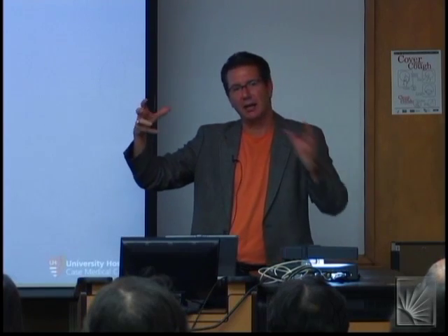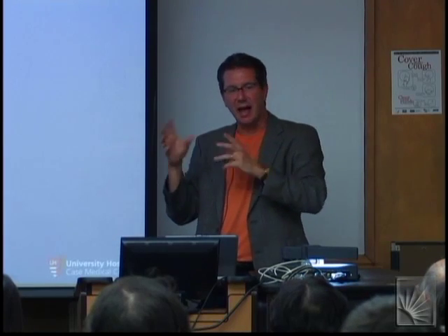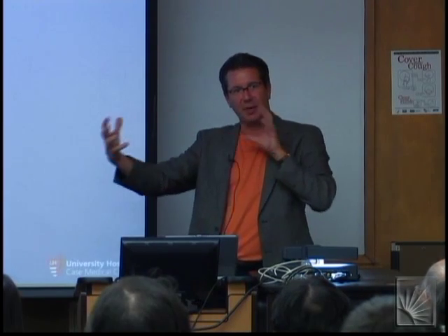So we can image much, much faster than we can reconstruct data, because we have to take that across all those arrays. If we do a non-rectilinear acquisition, we need to do the parallel imaging to create the data we didn't acquire, reconstruct it, and that kind of stuff. And it is done in spatial temporal space, right? Yeah, or time and spatial.